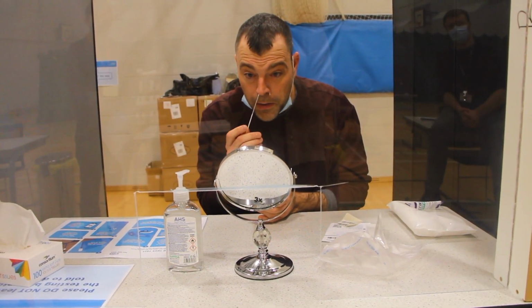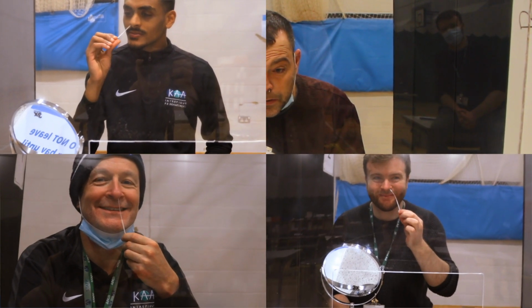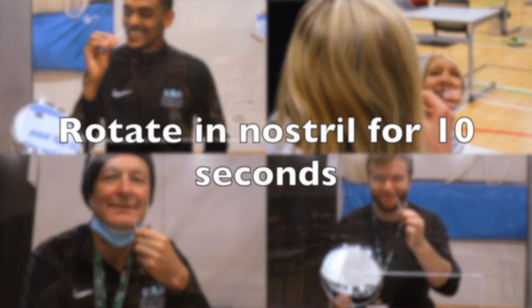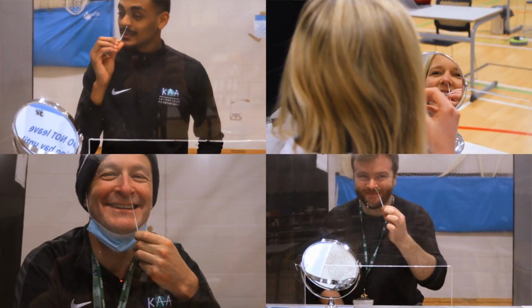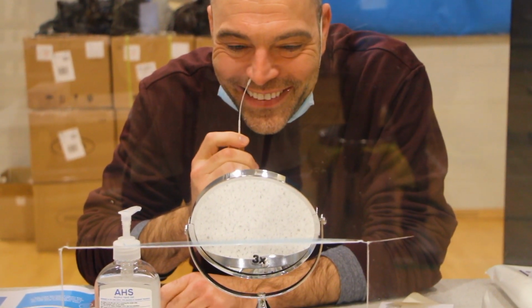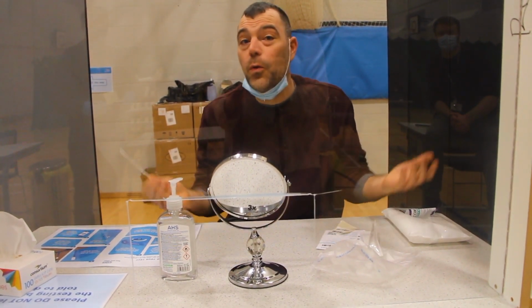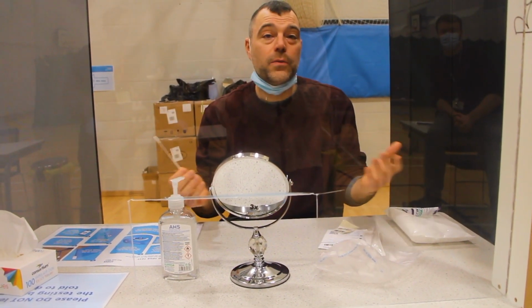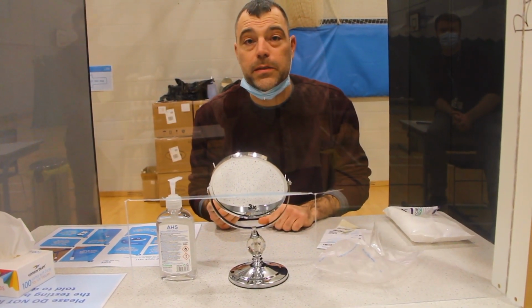And now I'm gonna do my nose. I'm gonna stay up here, and the instructions say I'm just gonna move this around. And there you go. It's painless, it's simple, it's part of all our lives now, and it's out the way. And actually, teachers are used to doing that on a weekly basis.